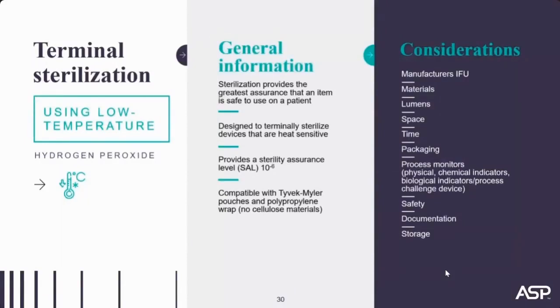there are some considerations. Is the device validated by the manufacturer to be terminally sterilized using a low temperature system? Is there dedicated space to clean, dry, and package the devices? Do you have storage space? How will the documentation be done? Will it be manual or automated using an instrument tracking system or other automated system?